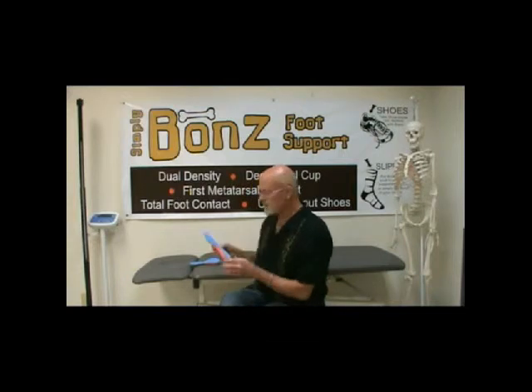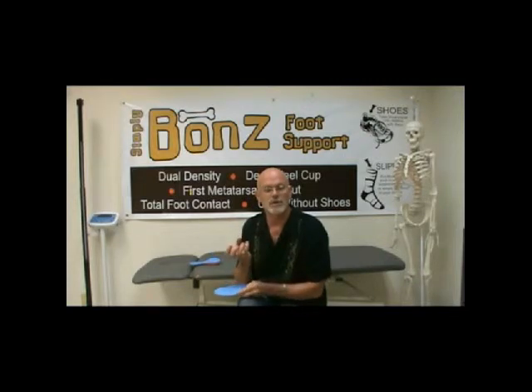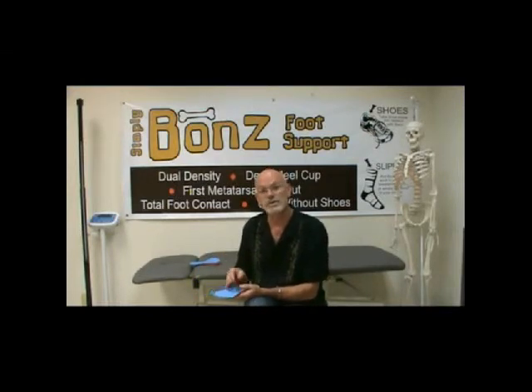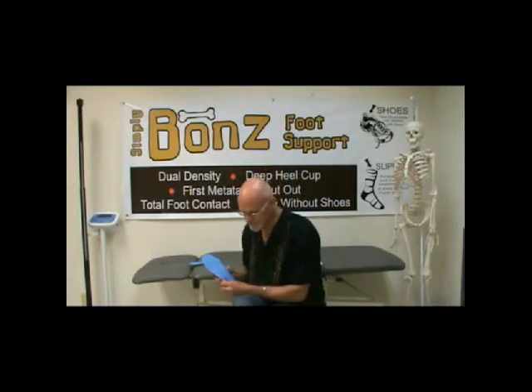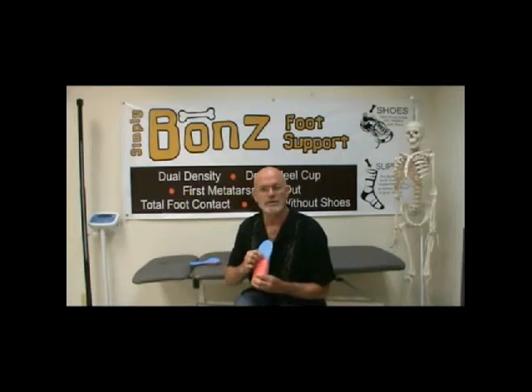So the idea behind a flexible insert that's really wrapped up high in the arch and captures the heel is not to stop pronation, but it's to decelerate it, to slow it down, okay? And that will reduce the damaging effects of pronation. These don't try to stop you from pronating, they just slow it down, okay? And reduce it somewhat.